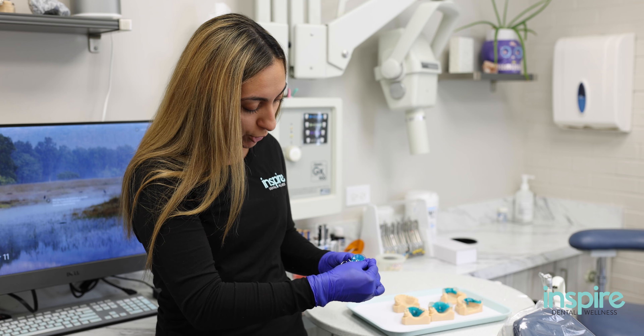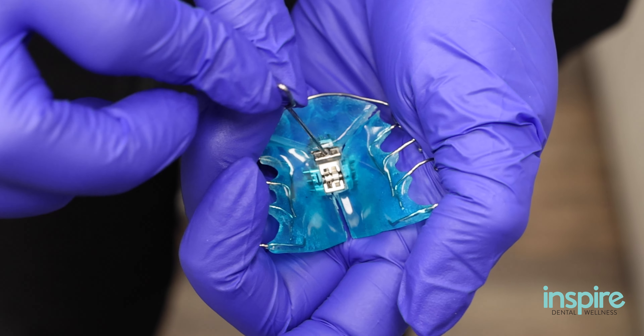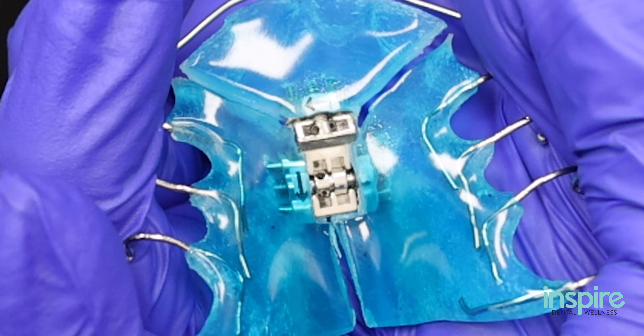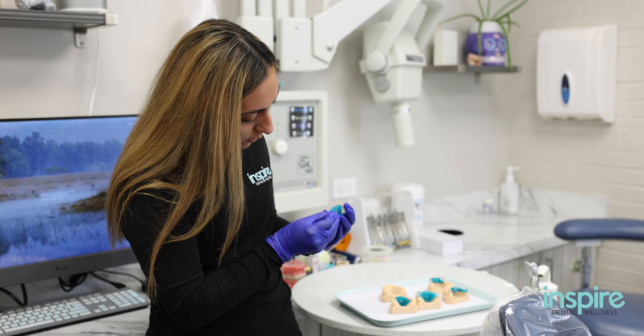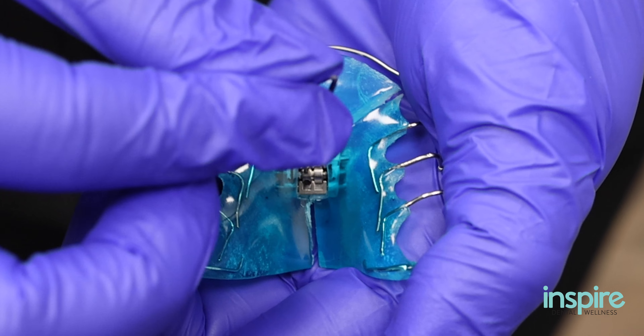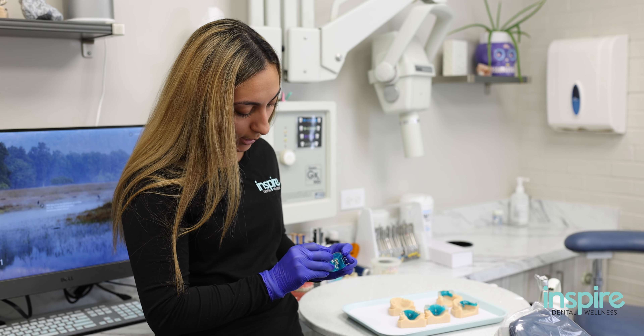When you go to turn it again the next time, pick up from where you left off, put the key in the hole, turn 45 degrees, take it out. And then this one is pointing down, so this one's a little trickier. You're going to just always go to the hole that you can see, turn down in the direction of the arrow, take it out. And then a new hole emerges — that's where you're going to turn the next time.